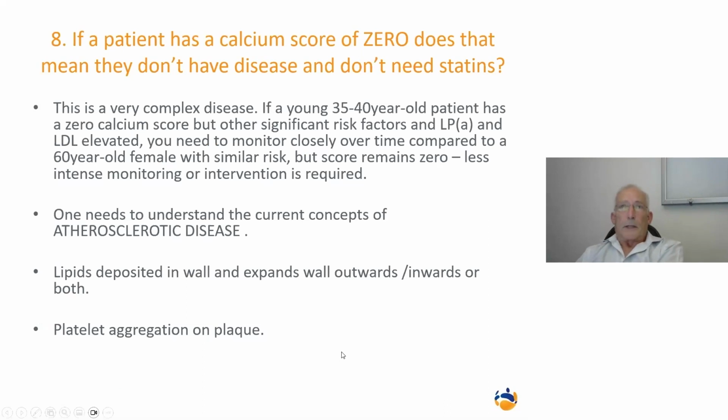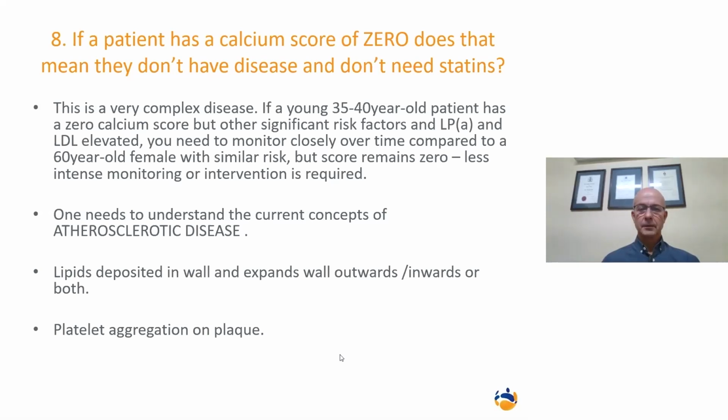So that's how you do it. Now, the next question, Peter, I'm going to ask you this question. If a patient has a calcium score of 0, does that mean that they don't have disease and they don't need statins? You've already answered this a little, but the issue of treatment and statins, just to clarify that, please.